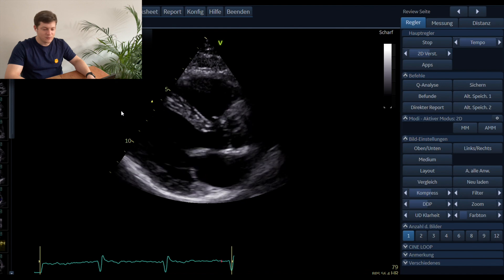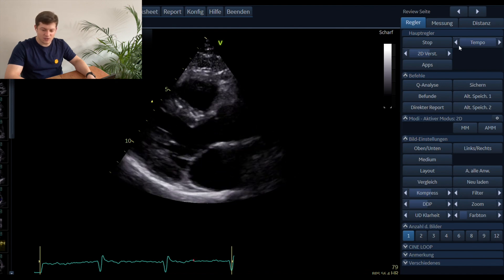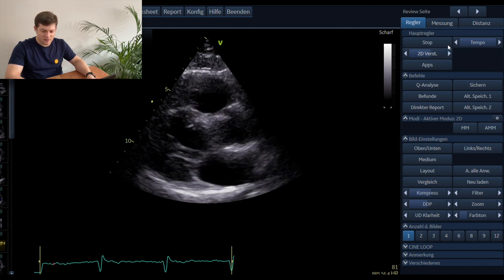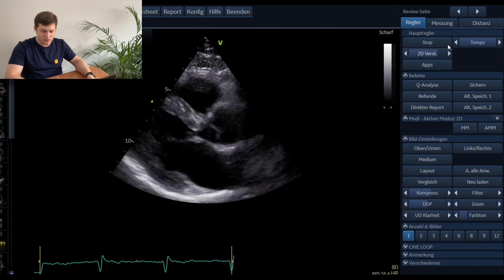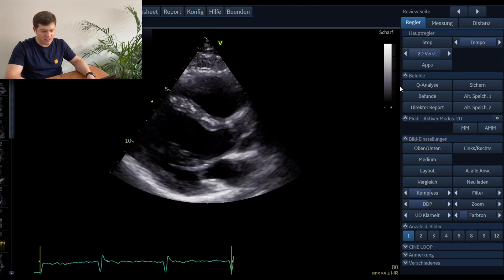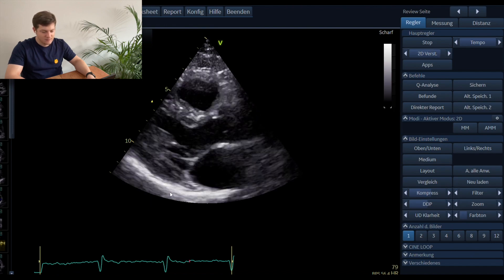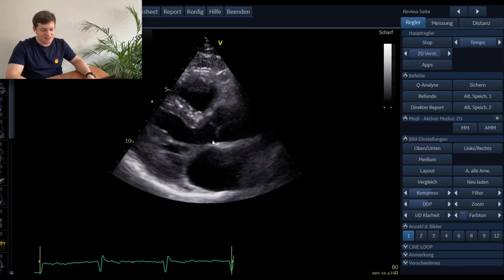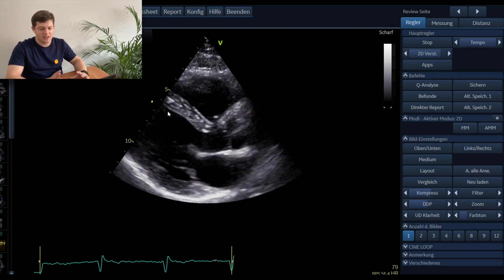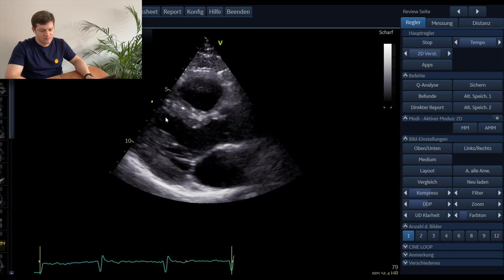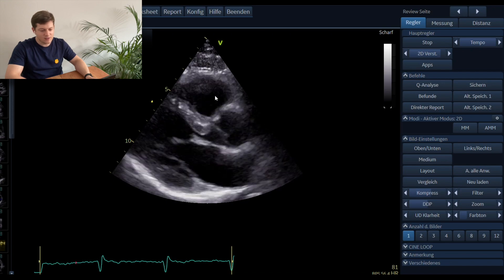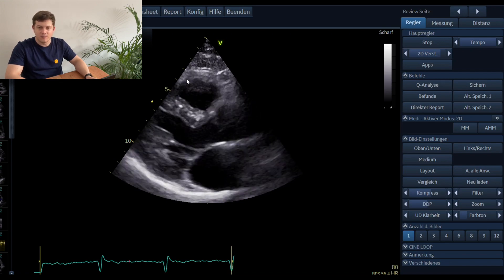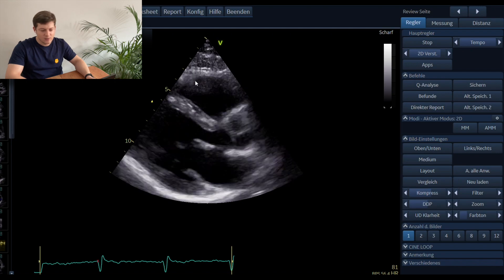You can already see some anatomical structures, but to visualize them better — also if you are reviewing after scanning in the software — you can make the image a bit brighter by increasing the gain so that you can really differentiate the entire organ.